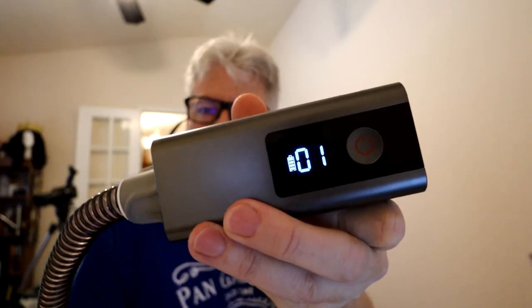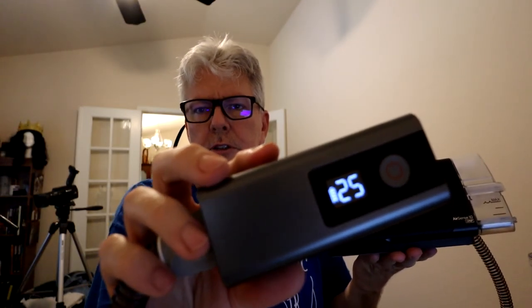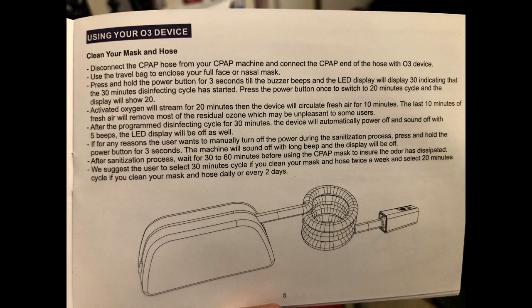We're down to the last minute. It's got a countdown for the last 30 seconds. And there we go — that's it. Shuts off automatically. You can just charge it and use it again and again. So the 30-minute option includes 20 minutes of activated oxygen — the O3 — plus 10 minutes of fresh air blowing through the machine. If you select 20 minutes, it'll be activated oxygen for 15 minutes and then five minutes of fresh air pumping through.